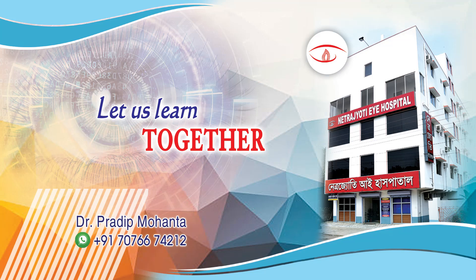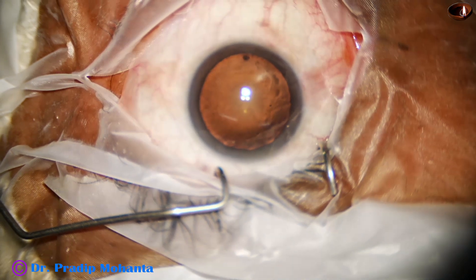Welcome to my workplace for hands-on FECO and SICS training. Let us observe this totally unedited surgery.